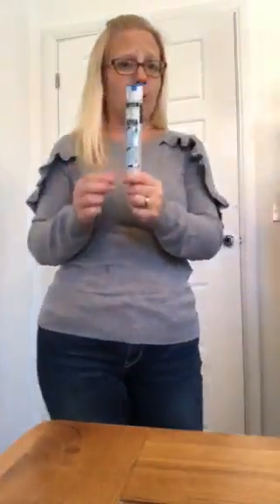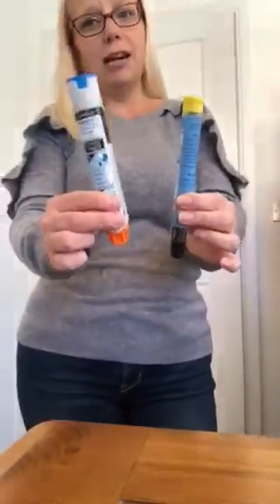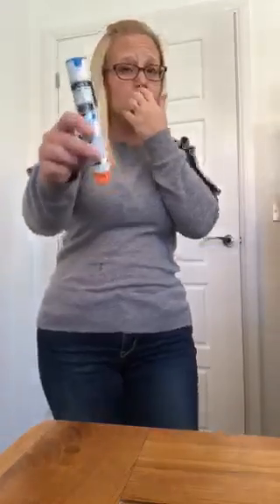If someone is having a reaction and their throat is swelling, and their breathing is becoming a problem, this needs to be administered. I'm not going into the ins and outs of what's happening in the body — I just want to demonstrate how these work. I'm holding two different pens: this one is called an Epi pen, the most common one, and this one is called a Jext pen. They both do exactly the same thing. This is a training device; real ones look pretty much the same.